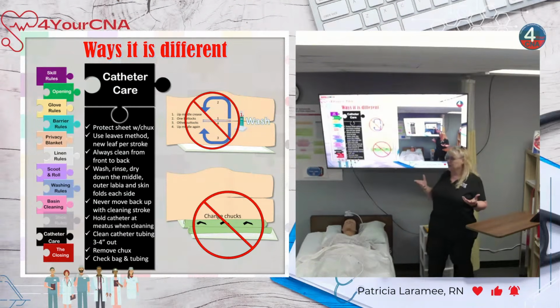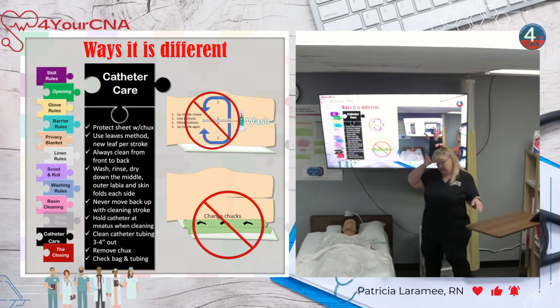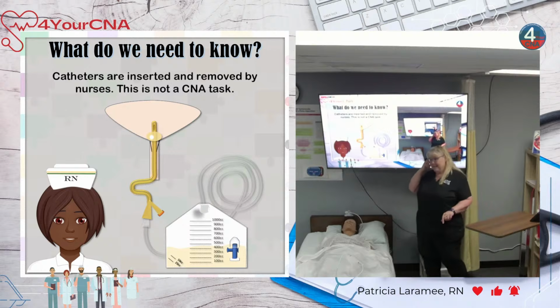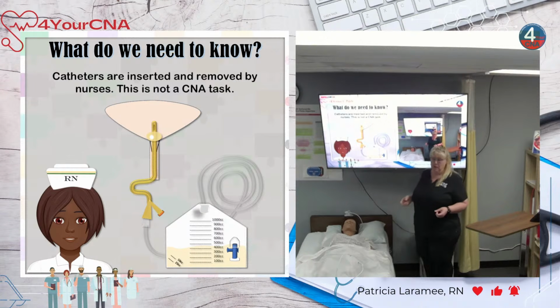These are our differences. We're not going to clean the backside. We're not going to leave them on a chucks. What I need to teach you with this skill is what a catheter is, how it works, and make you a little less afraid of the catheter. That's what I have to teach you with this skill, because everybody's a little freaked out over catheters. So we want to talk about it.